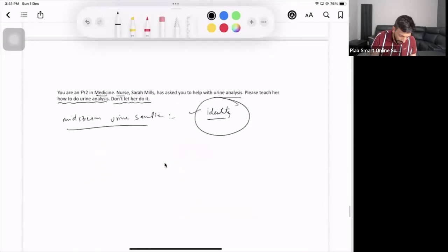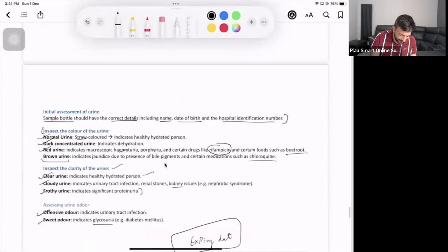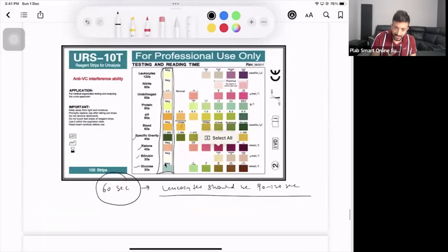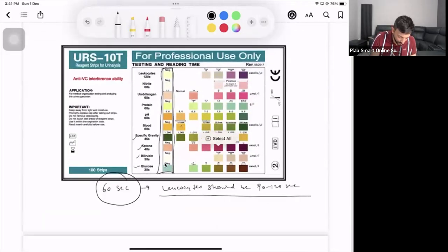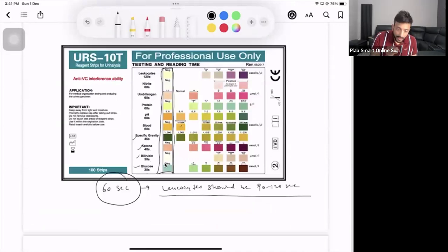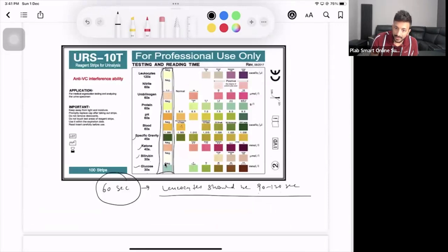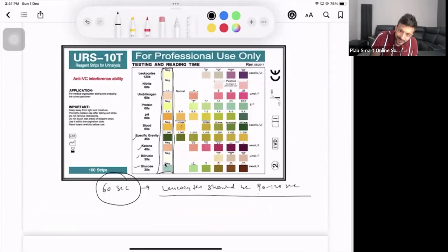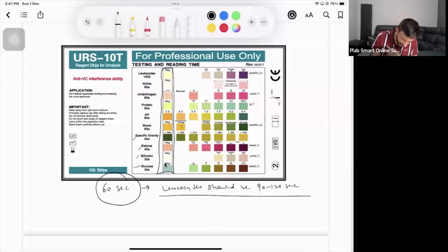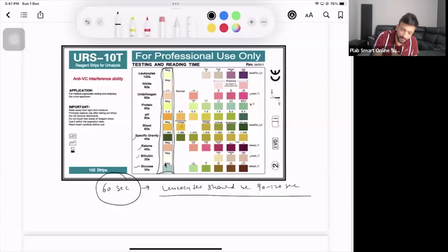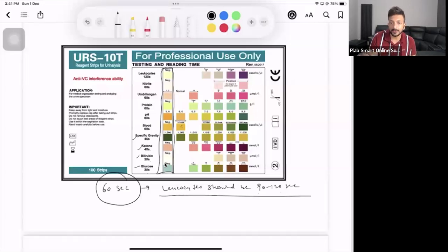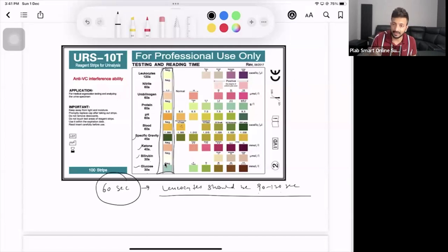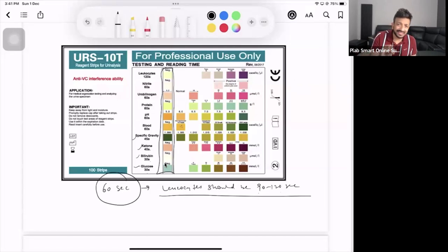After one minute or 60 seconds, start reading - check for glucose, bilirubin, ketone, and specific gravity. When you reach leukocyte, make sure the timing is in total 90 to 120 seconds. If you start from glucose and reach leukocyte, it's going to be an extra 30 seconds already. This will be written on the bottle - you don't need to learn anything about it.